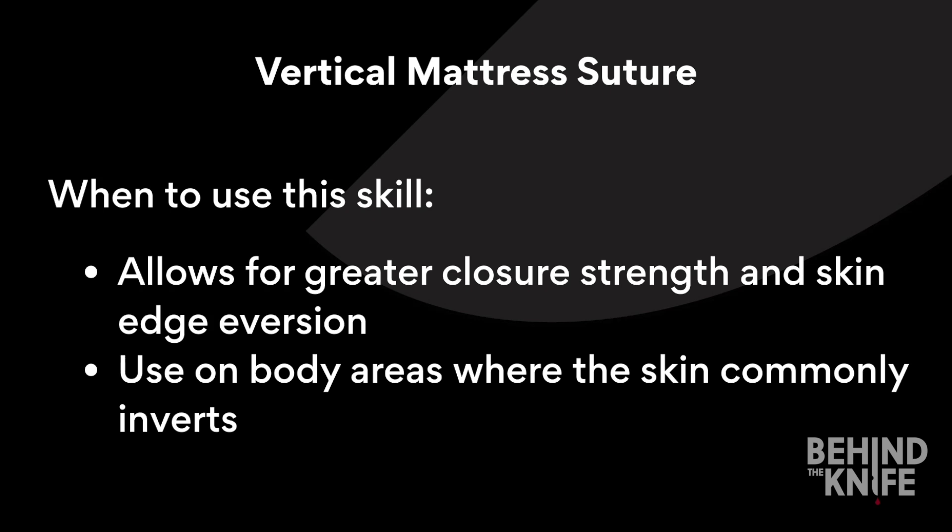The vertical mattress stitch allows for greater closure strength and allows for better skin eversion. The suture is good for areas like the posterior neck or other body areas where the skin commonly inverts.